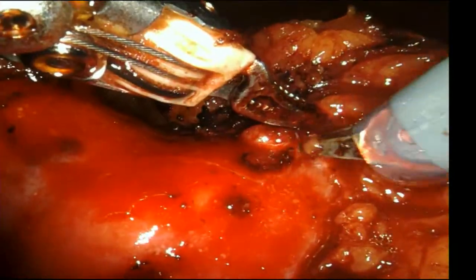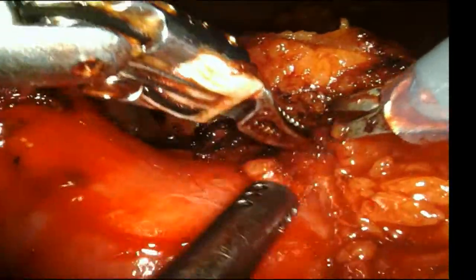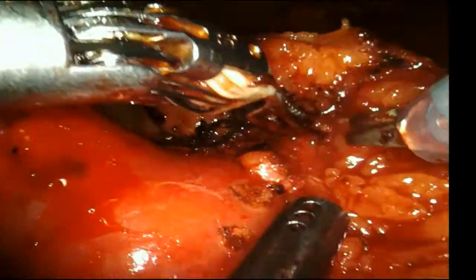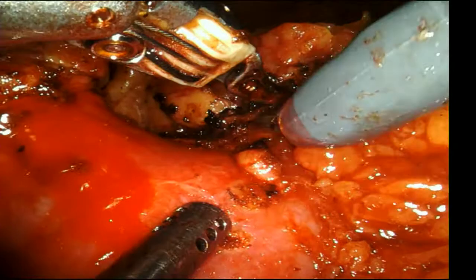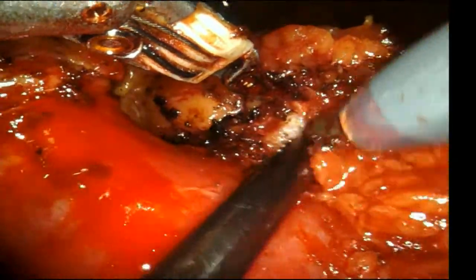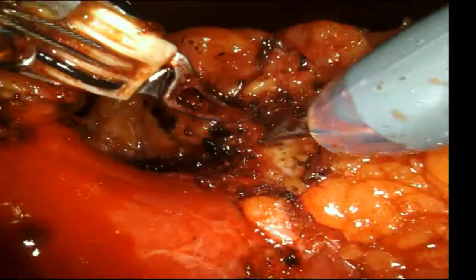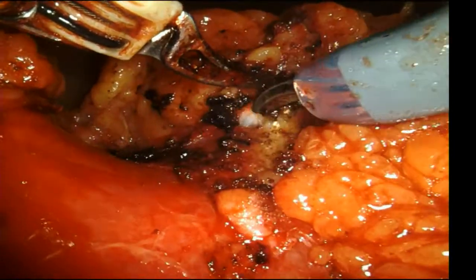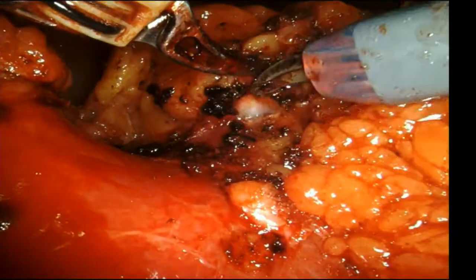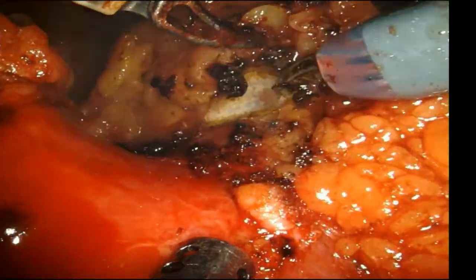I have a nice video clip my fellow worked on where we show an example of what looked like a very easy tumor. You could just look at the outside of it and think, okay, I know exactly where to cut, and then we show the ultrasound, and it saved our booty because it was much different than what we expected. The tumor was much deeper than we thought, and it completely changed our plan for resection. So sometimes it'll save you. It's not a luxury item. It's a necessity. Don't leave home without it, as they say.